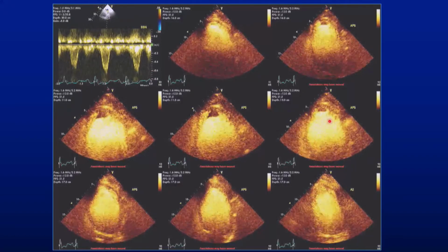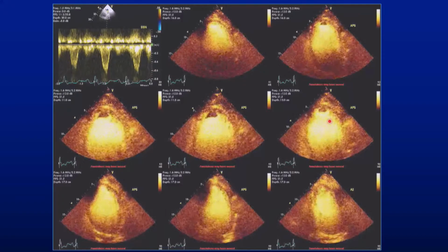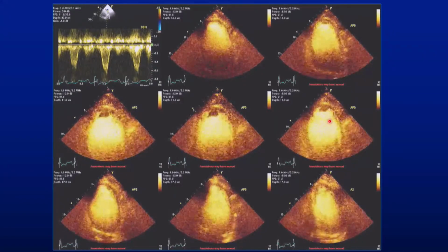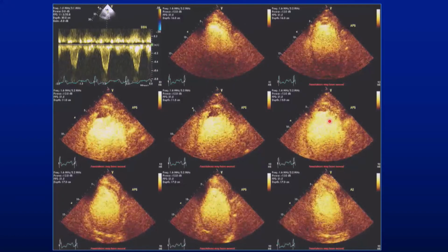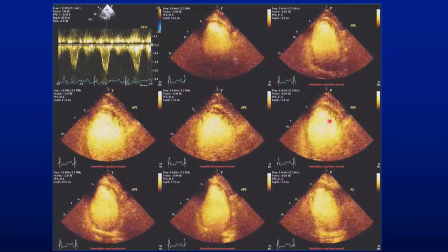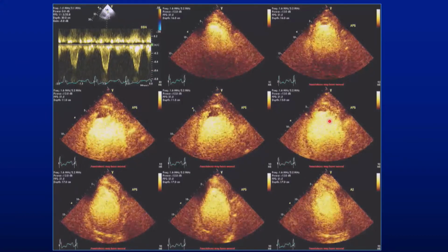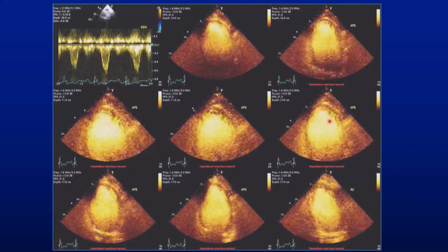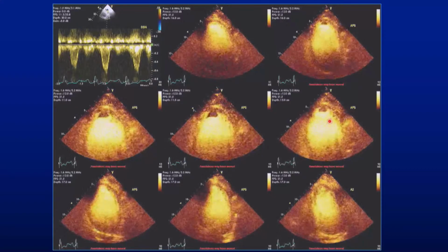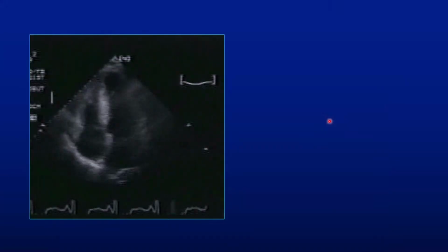So it would change, because I could not see all the segments, particularly in a depressed ventricle. In truth, if I have what looks like a normal heart, I'm missing maybe one segment or two, depending how strategic that segment is. I may not have a major issue, as opposed to a bad ventricle where I miss an apical thrombus. So I want you to keep that in mind when you're doing echocardiography.